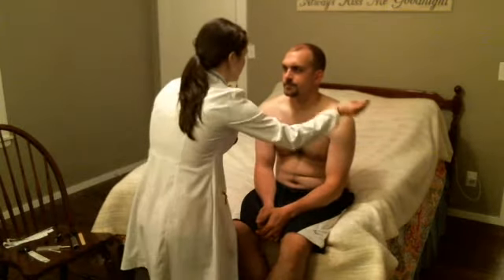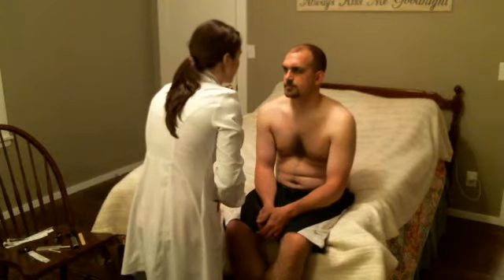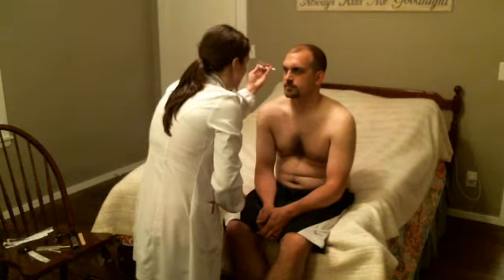I'm now going to use a bright light in your eyes and check for direct and consensual pupillary constriction. You look at me. I'm going to shine a bright light in your eyes. Direct and consensual in both of his eyes. And same in that eye, direct and consensual in both of his eyes. I'm now using my ophthalmoscope. I'm going to check his red reflex.